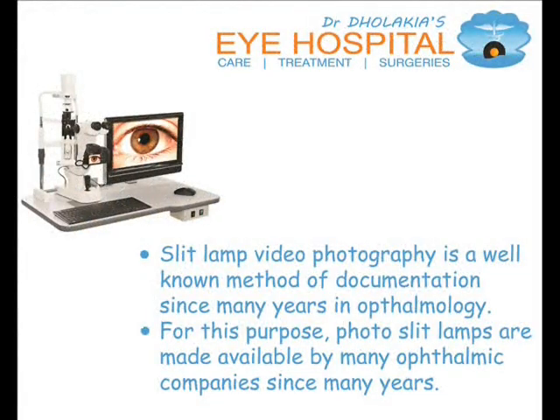Slit lamp video photography is a well-known method of documentation since many years in ophthalmology. For this purpose, photo slit lamps are made available by many ophthalmic companies since many years.